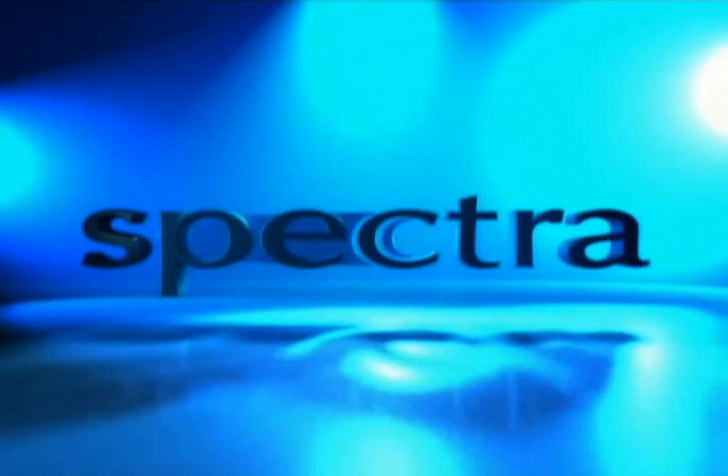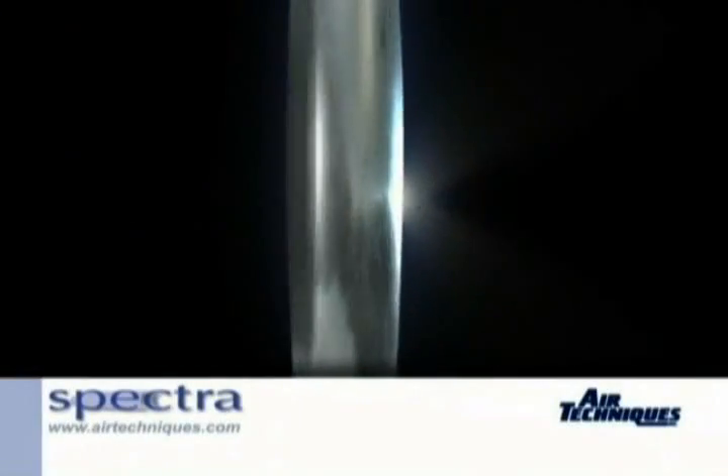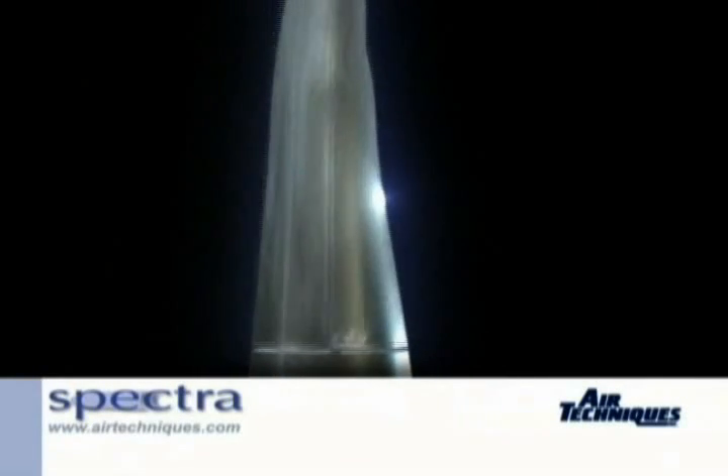Air Techniques is proud to introduce Spectra. Spectra is the first non-invasive hand-held digital imaging instrument designed to aid in the visual detection of caries by measuring increased light-induced fluorescence.